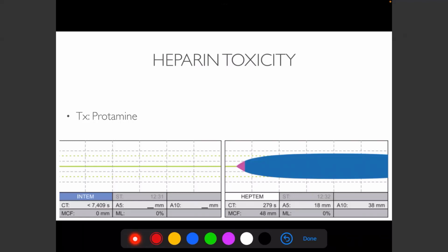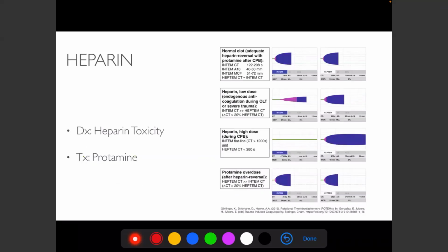They could be lysing because they're just on circuit and all that, but you really want, because you can only pick 4. So you really want to, and you can always rerun it, which isn't cost effective, but you've got to, at least until the first one, and you know it's not the heparin that they got in the OR, you have to include it because that's an easy thing to miss and it's an easy fix. So I want to do a little bit next level on that topic specifically because it's really pertinent to here.